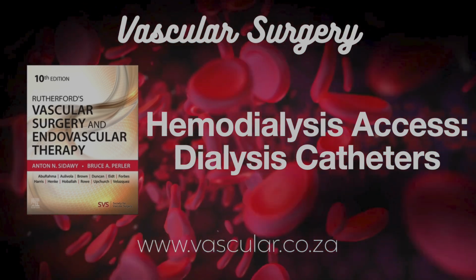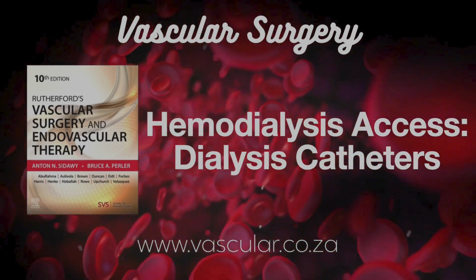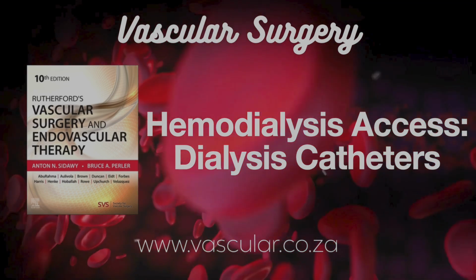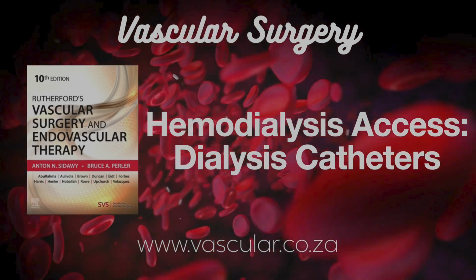What about antibiotic locks or guide wire exchange? Do they help avoid removal? Studies suggest antibiotic locks, sometimes combined with exchange, can have good cure rates for some infections, better than systemic antibiotics alone, especially for bugs like coagulase-negative staph. Less successful for Staph aureus.